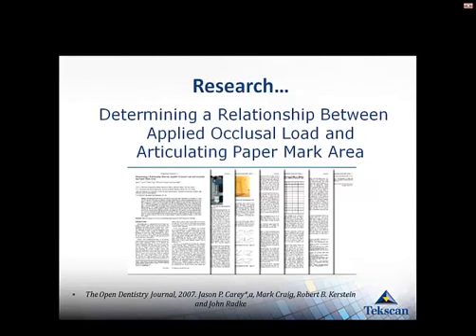The next is research, and I don't want to spend a whole bunch of time going through this, but there are a significant amount of papers that have been done. If you're interested in looking at any of the research that we have, please email me, have that be one of your questions. I can send you over our bibliography. The one paper I'd really like to look at is the one that sticks out the most to me as kind of a game changer.